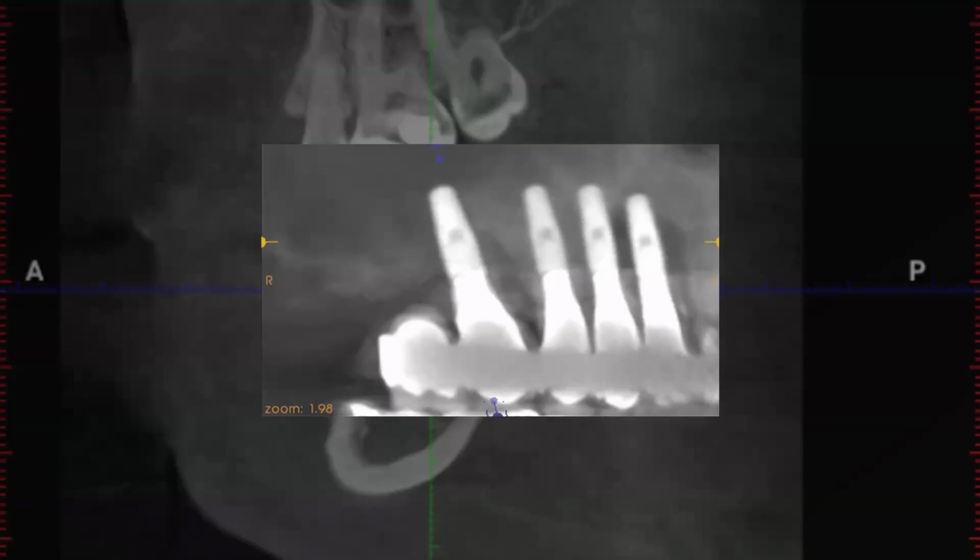If you read any implant book, it recommends not placing implants in the case of sinusitis until that gets taken care of. Consult with an ENT, get that under control. And so, yeah, they sunk these implants well into the sinuses. And this patient continued, I should say, to have sinus problems. They saw the ENT, and the ENT sees these implants, and where do they point the finger? Like, well, these implants are causing the problem.